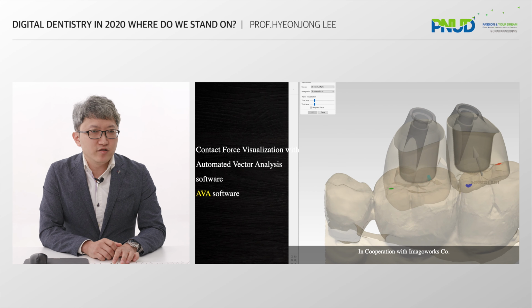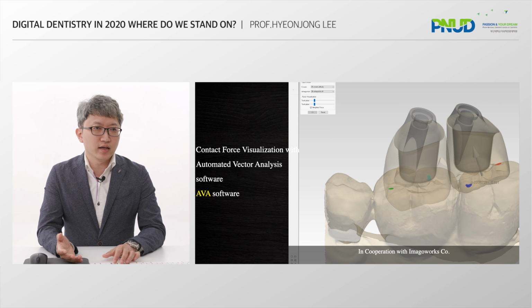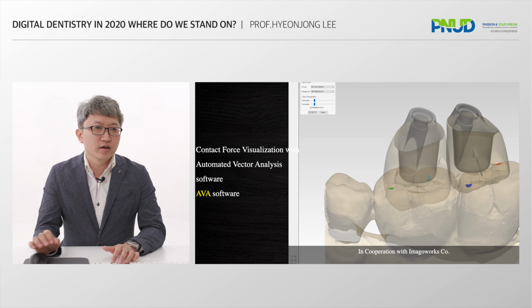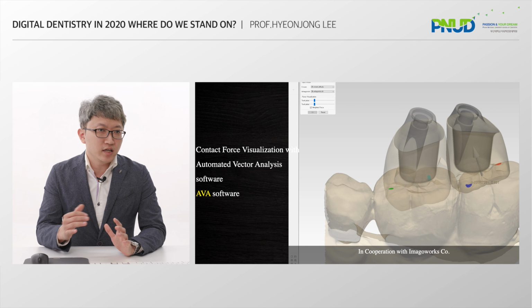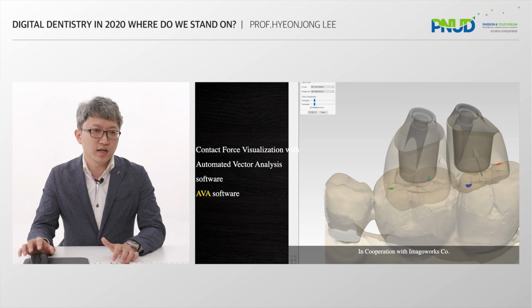So this concept can be used during the design process using exocad or the 3Shape dental system or something similar. Before finalizing the design in the CAD software, if this analyzing function is integrated into the dental CAD software, like exocad, this would be really nice. It should be performed easily, just by clicking one analysis button in the CAD software.